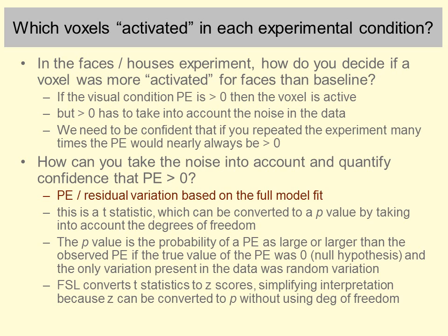Okay, so the full model fit is the time course which is the best prediction we can make of the time course in a voxel given all our explanatory variables, and the residual variation is just a time point by time point comparison of the actual value of the data with the model prediction, and you calculate all the differences from the model, sum them, square them, etc.